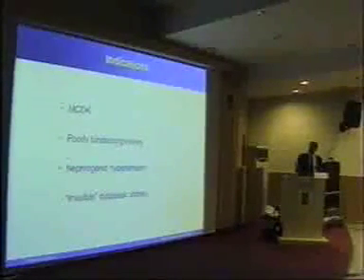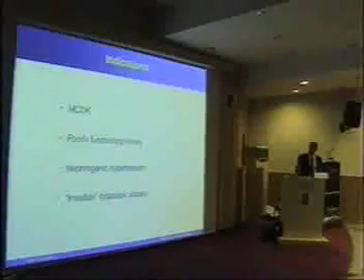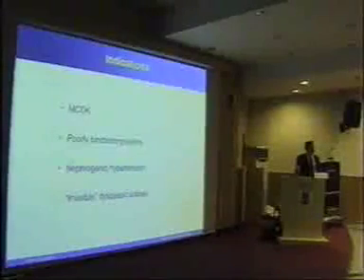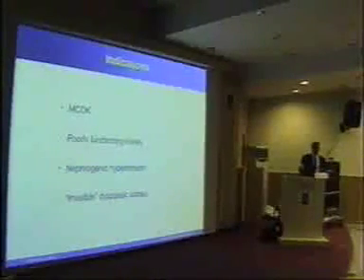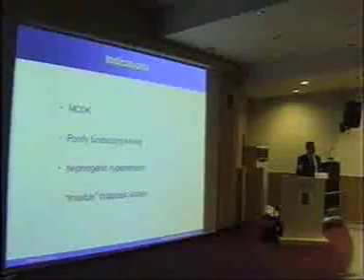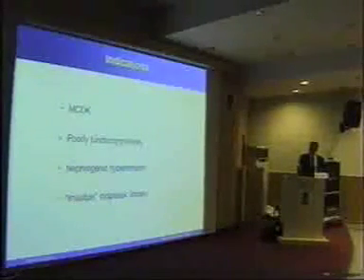Multicystic dysplastic kidney, poorly functioning kidney for whatever reason. Nephrogenic hypertension, it works really well for this if you've got a unilateral abnormal scarred, poorly functioning kidney, and you remove it. We've shown in a recent paper that is about to be published in the British Journal of Urology that when you take out the kidneys laparoscopically in these patients, it's not the technique of laparoscopy, obviously, but it's very quick to resolve the hypertensive problem, and it's a nice indication for laparoscopic nephrectomy.